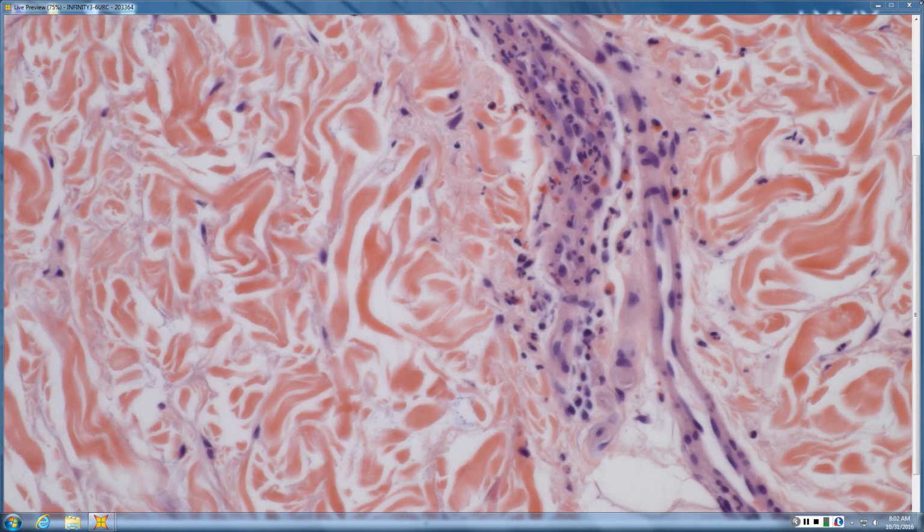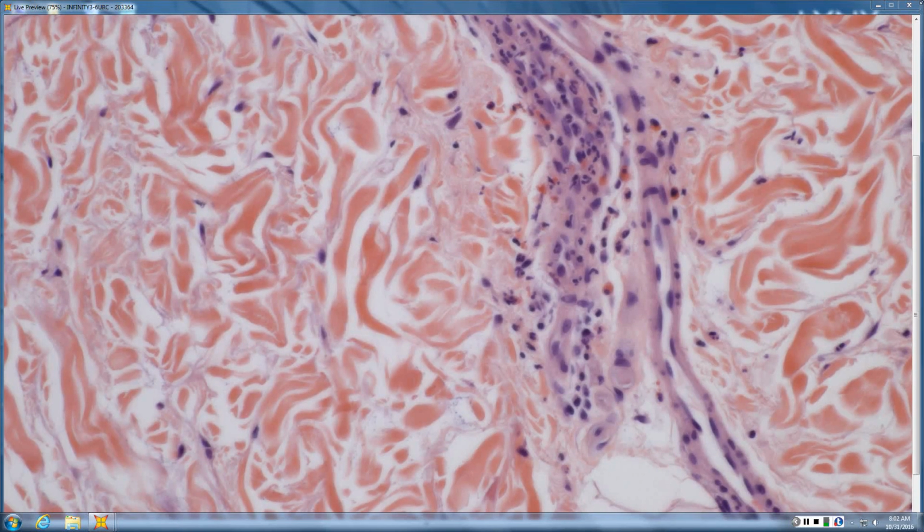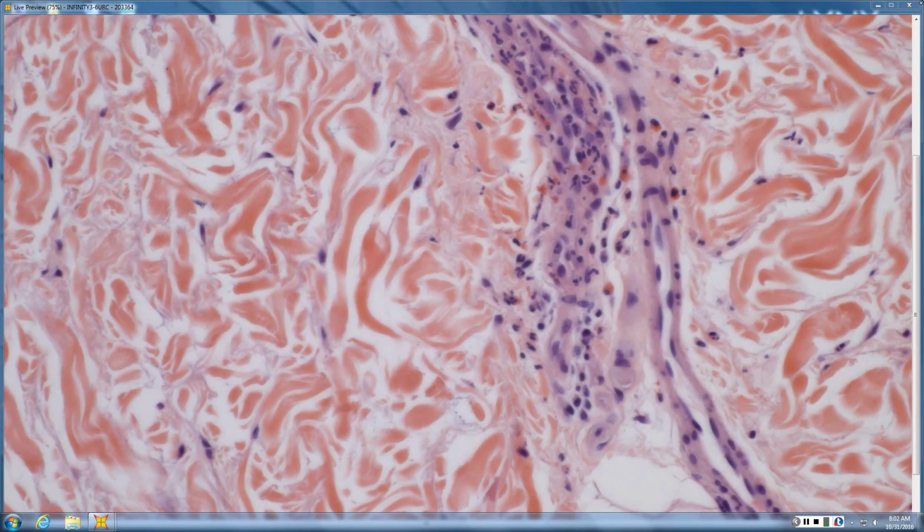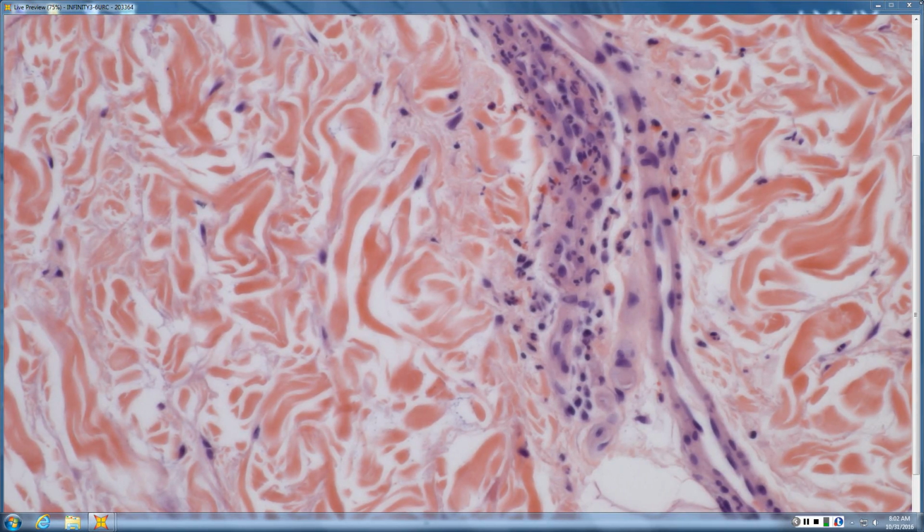That's late-stage Still's. So early Still's is neutrophilic with no karyorrhexis, just like urticaria, but the EOs are never invited to join the party. Later, exanthem-like Still's, you may have that sky-high ferritin. You have lots of individual dyskeratotic cells in the epidermis, like incontinentia pigmenti. And then late Still's, a starry, starry sky pattern in the corneum where you have whorls in what should otherwise be a basket-weaved corneum.